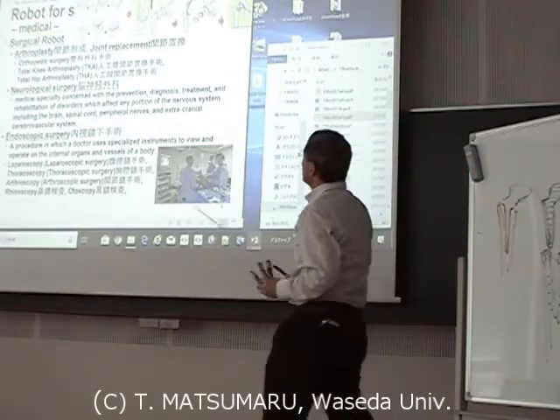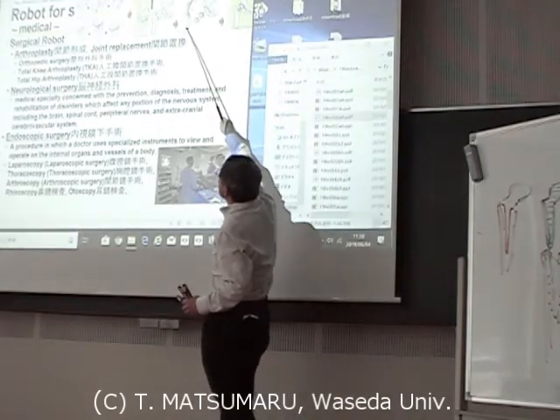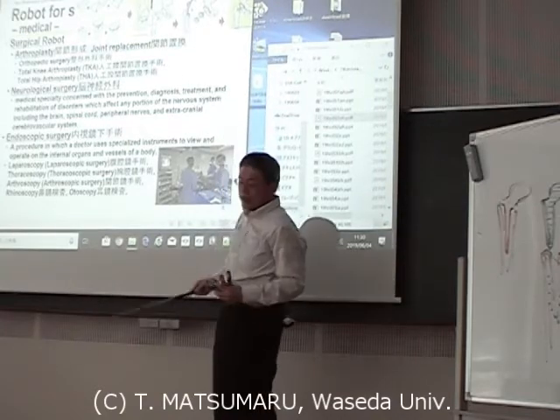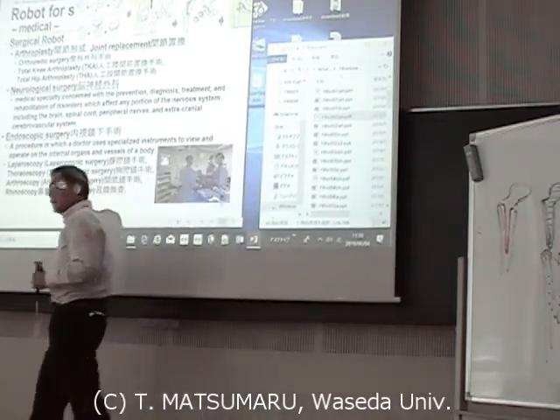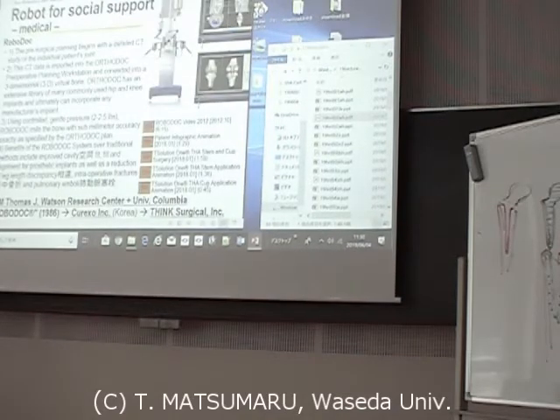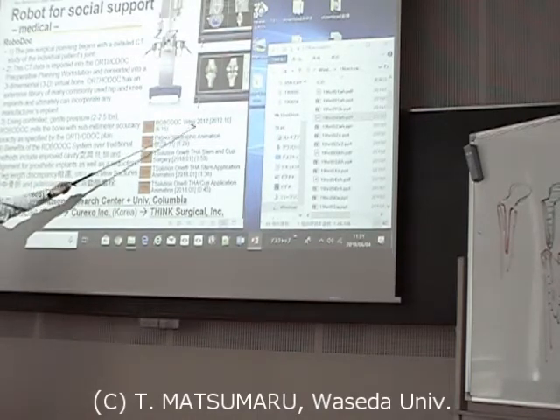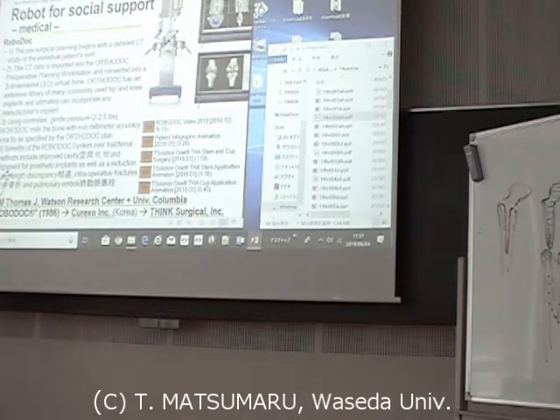So therefore, by using the robot, this hole should be made clearly and precisely. So therefore, firstly, this Robodoc was developed more than 10 years ago.